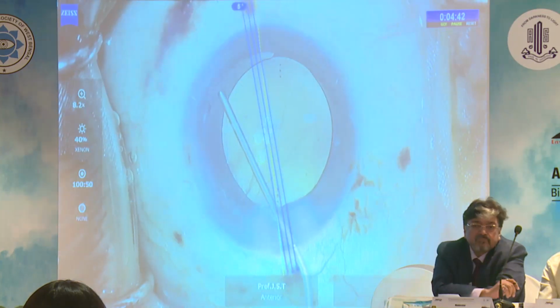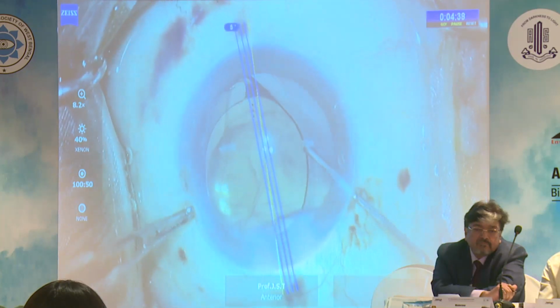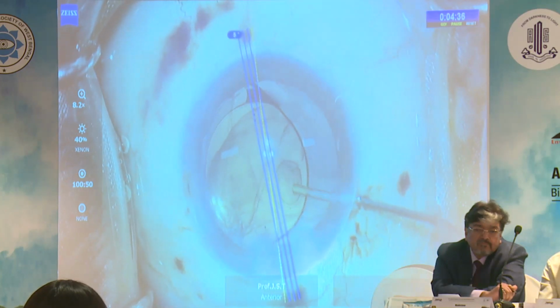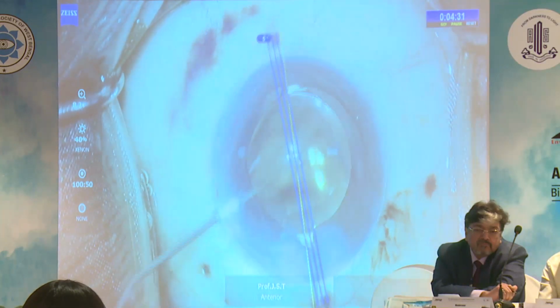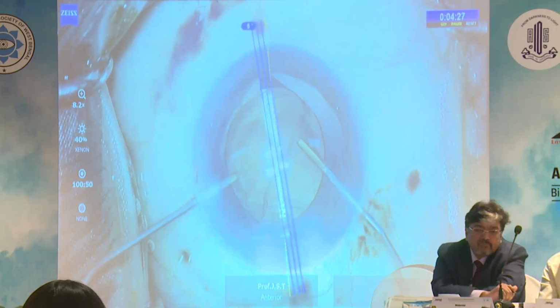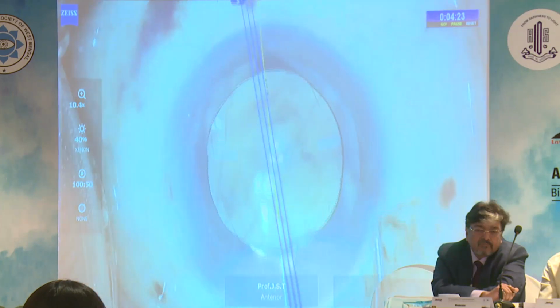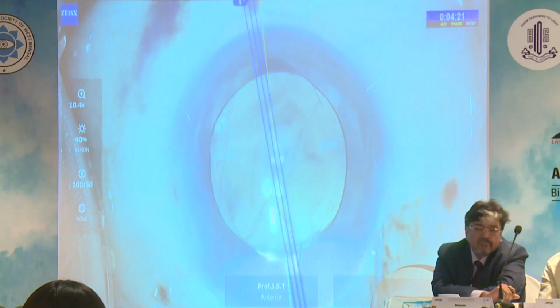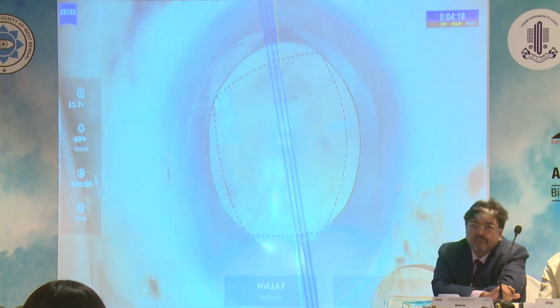As soon as the PCR was recognized, visco-dispersive OVD was used to tamponade the tear, and subsequently, a gentle bimanual technique was used to capture the optic from either side, above the anterior capsulorhexis. On completion of optic capture, the intraocular lens was stable and the anterior rhexis margins attained a quadrangular shape due to peaking at 4 corners.